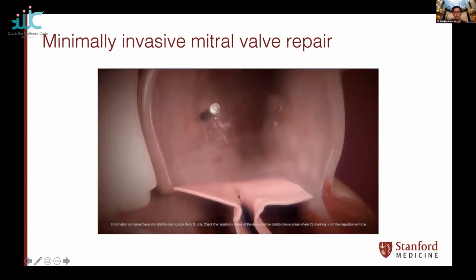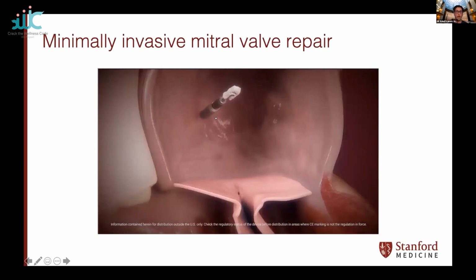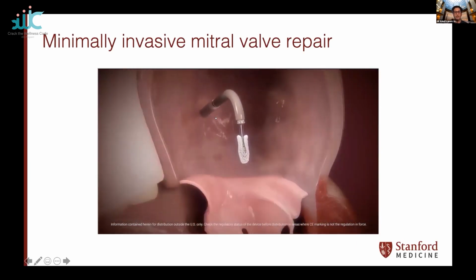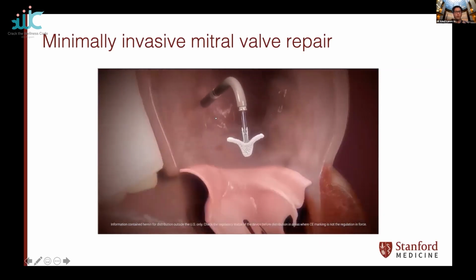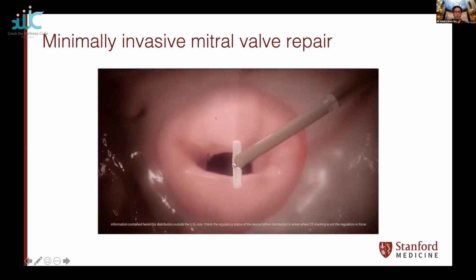We do all of this just under X-ray in the catheterization laboratory, just the same place where you would have a regular coronary angiogram. We steer this clip down to that abnormal valve. We orientate it in different ways. So it's almost like a robotic procedure, but we're doing it via human hands, not via a robot.